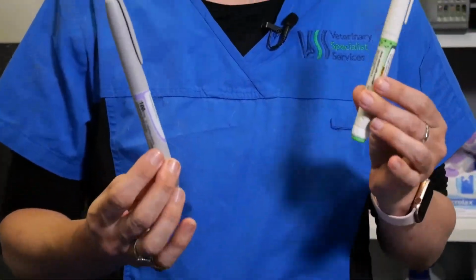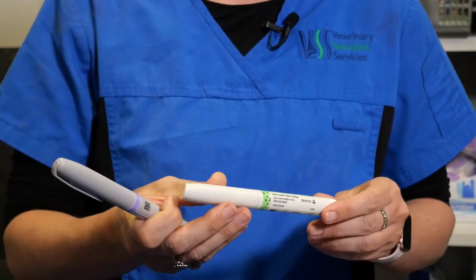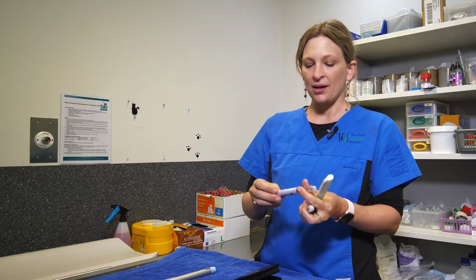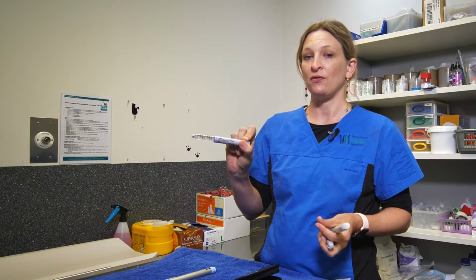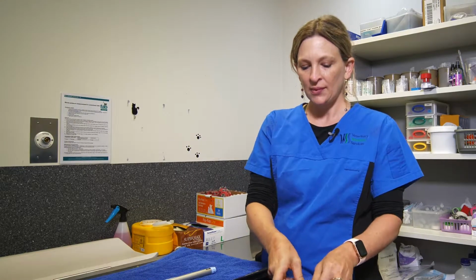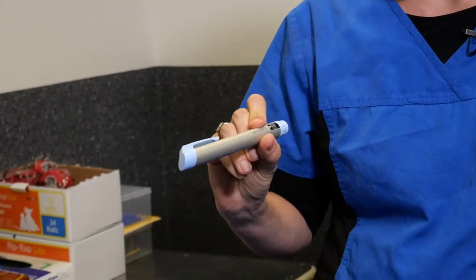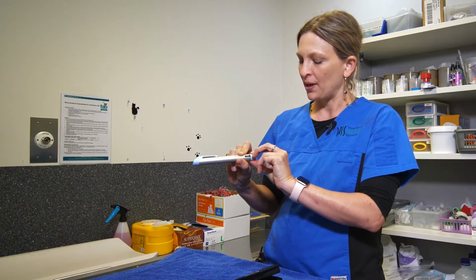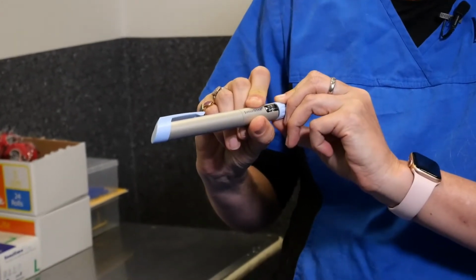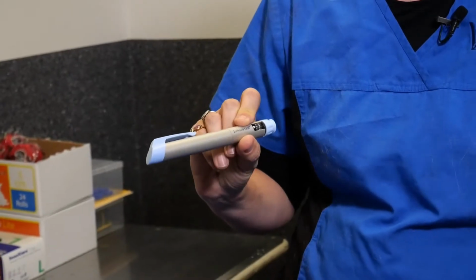There are other pens available as well for glargine insulin. This is the Lantus Solostar, and this is the Toujeo Solostar pen as well. These are essentially disposable pens, so when you've used the pen up, you throw the whole thing out. The one that we'll focus on primarily is the Junior Star pen. This is a really great pen because it's one of the few pens that allows you to do half doses of insulin, which sometimes we might need to use in our cats.